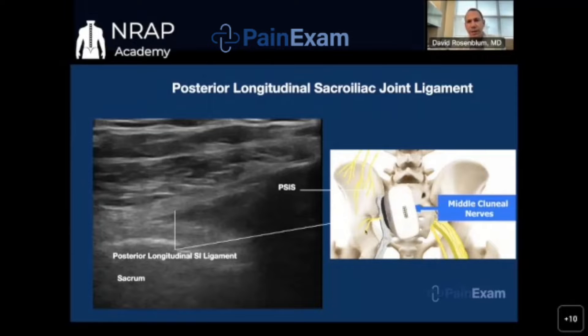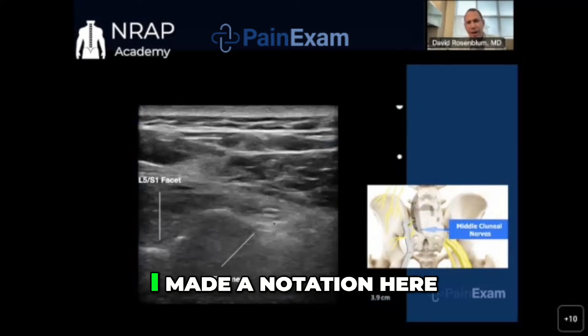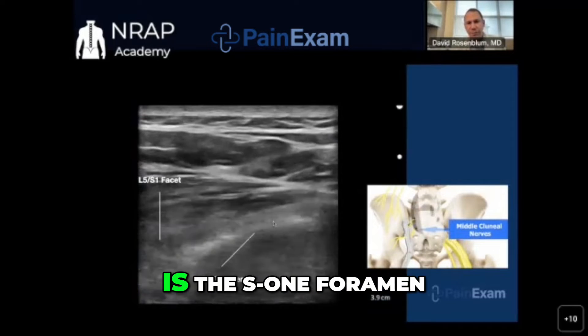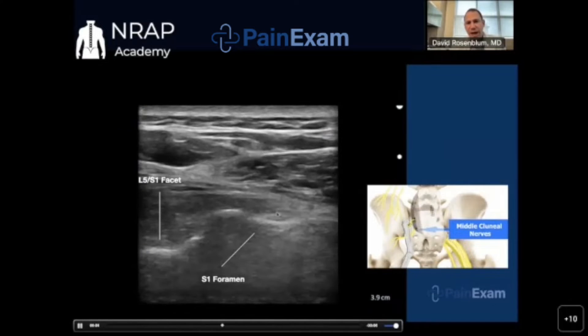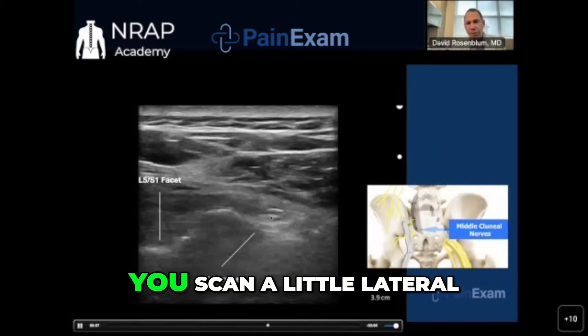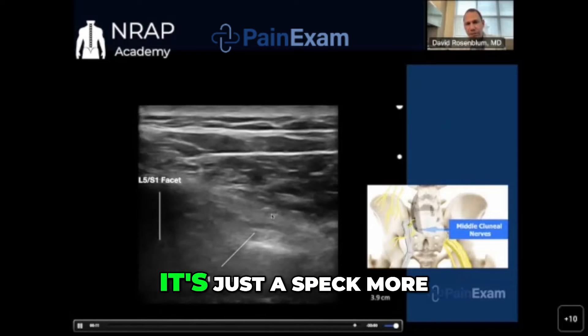It's one of those nerves that are very difficult to see. I made a notation here — I think the nerve is at this S1 foramen. I'm scanning at the L5S1 facet; I think the nerve is somewhere over here. You scan a little lateral to the foramen and it's just a speck, more or less outside the foramen.